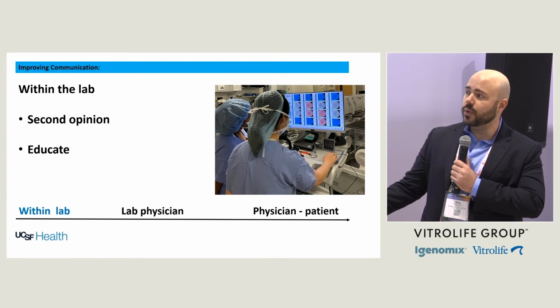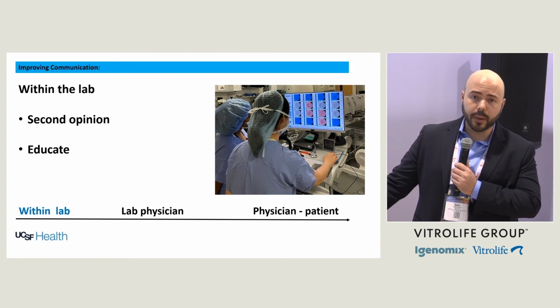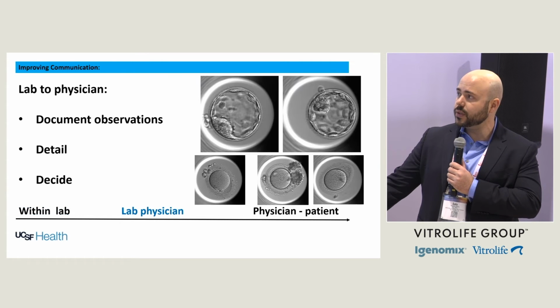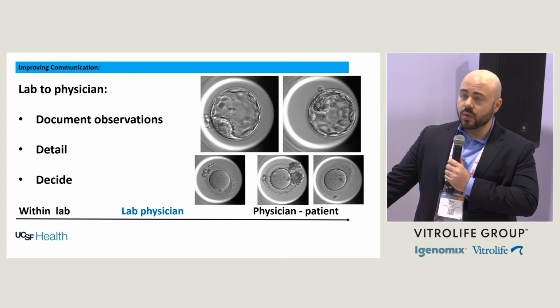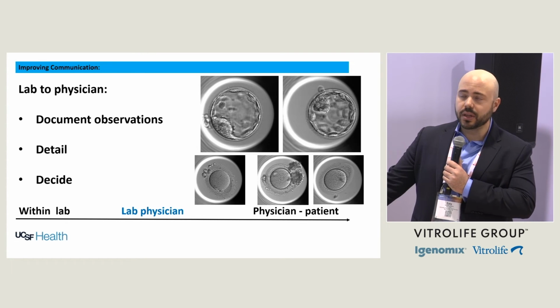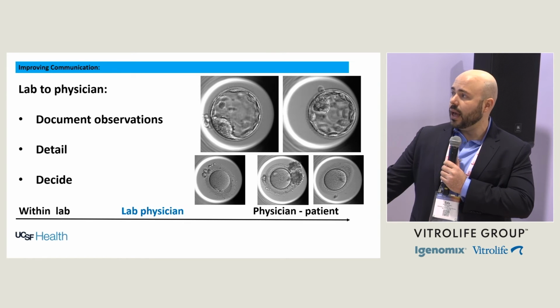You can educate. We at UCSF, we have fellowship and residency programs. So we do have a lot of personnel or students rotating through the lab to learn more about what we do in the lab. So we do a lot of education with those images. So now, when we want to convey a message to a doctor about a patient or about a case, and we want to write, what does this embryo look like? Well, now we can send an image directly from our EMR to the doctor in a more efficient way, because we can give a video of how this embryo is being formed, and we can make a decision.